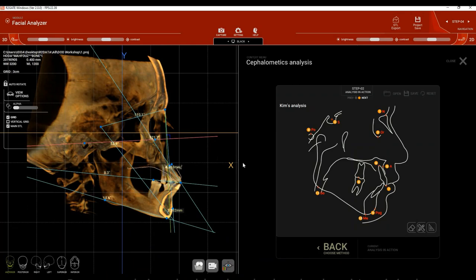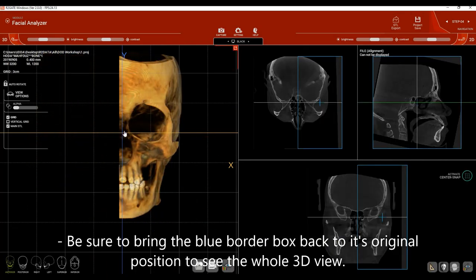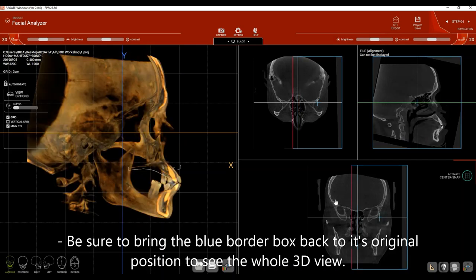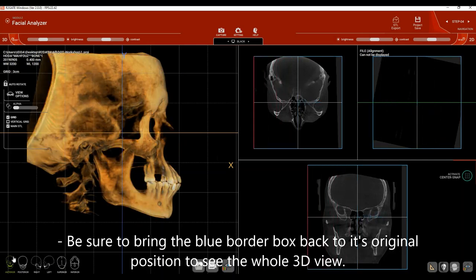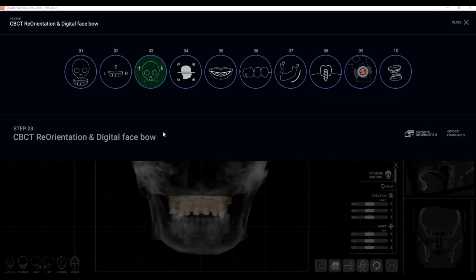Before moving on, click Close, move the blue box all the way to the right side to see the whole 3D image. The next step is Digital Face Bow — go to step number 3 in the software, which is CBCT Reorientation and Digital Face Bow.